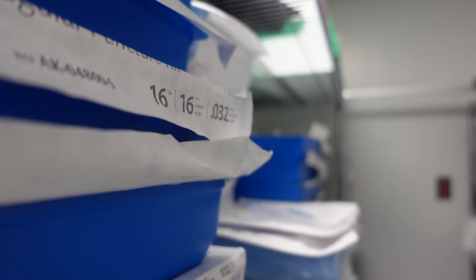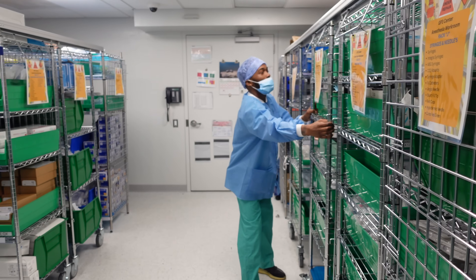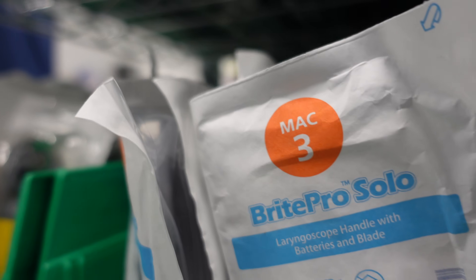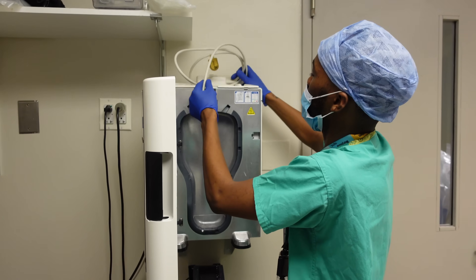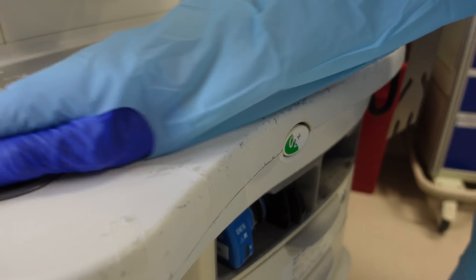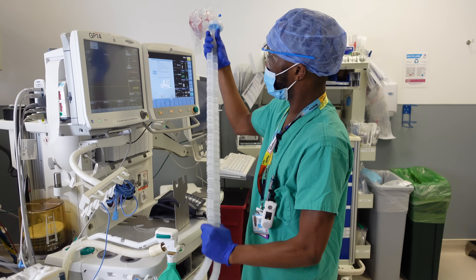When I go back to the equipment room, there are rows and rows of equipment. How do you learn the names of everything and what everything does? Before you even start, you have a packet of what the equipment is called, what the equipment function is, how you clean it, and what the drying time is — it's everything. The most common call I'll get is turnover, basically. Just when the case is over, come and wipe the machine, make sure everything is there, and stock for the next case.